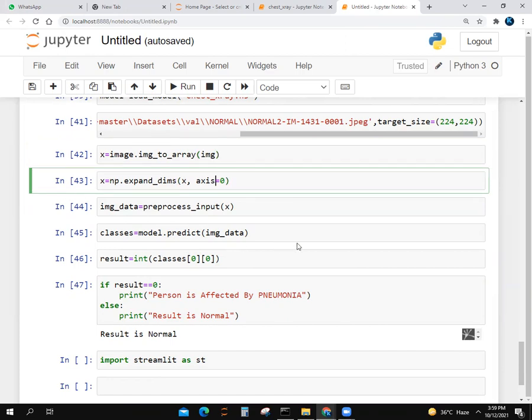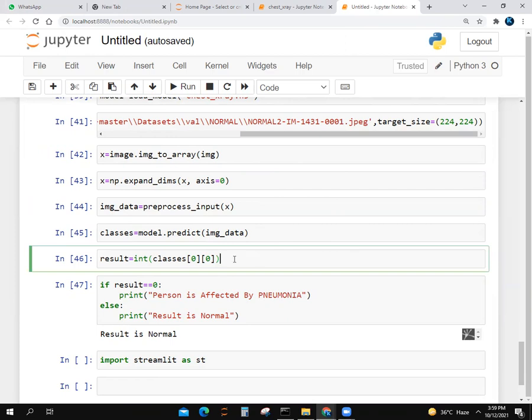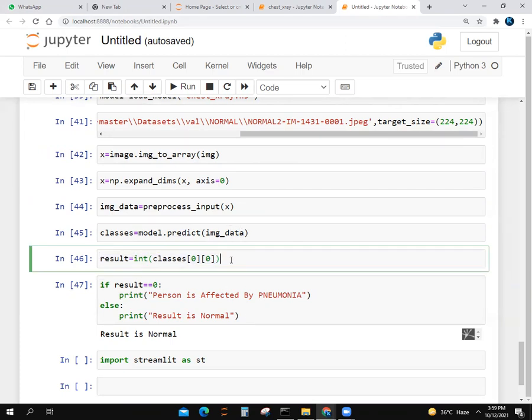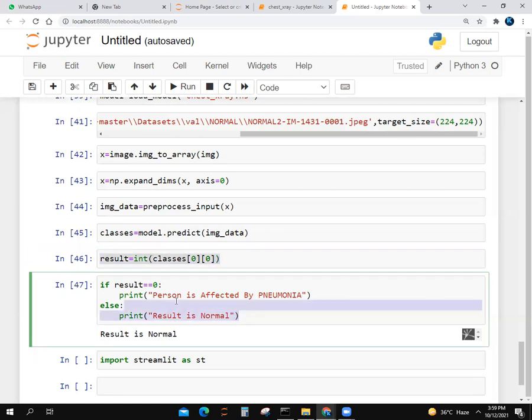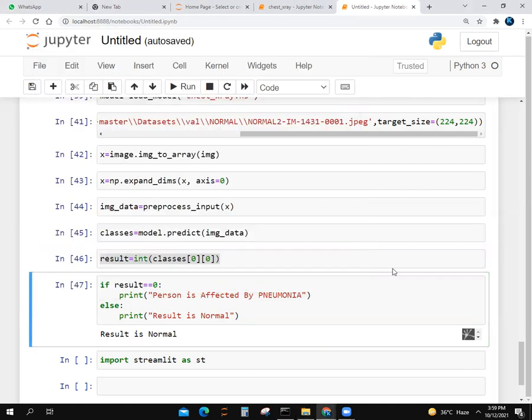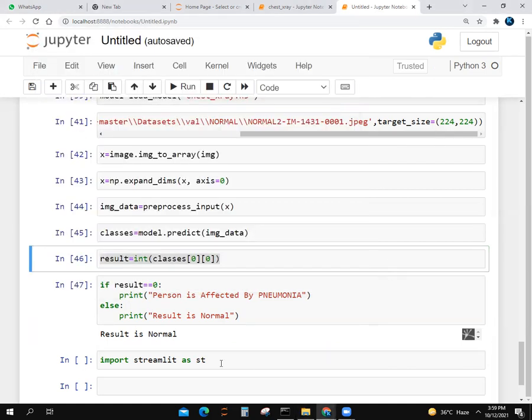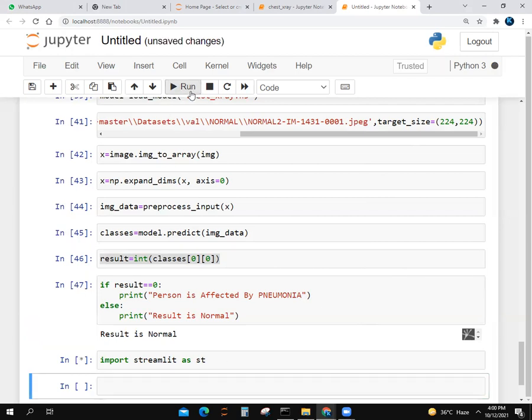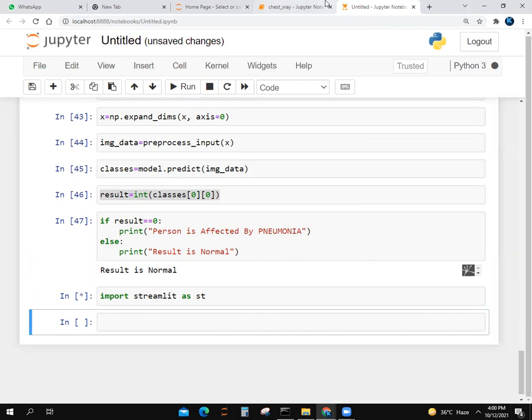Classes equals model.predict with image data. It's predicting our model. Result equals np.argmax with classes at [0,0]. If result equals zero, the person is affected by pneumonia, else result is normal. We wrote result is normal because we took a normal image from the folder. These are normal images. After that, we import streamlit as st.